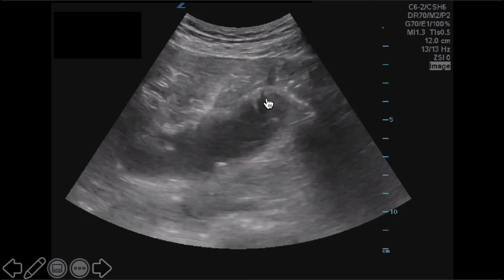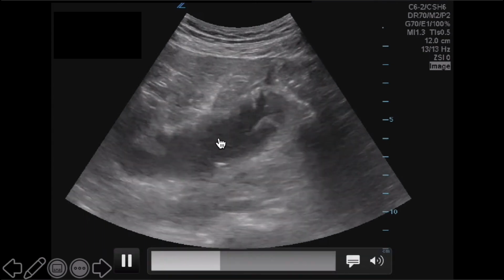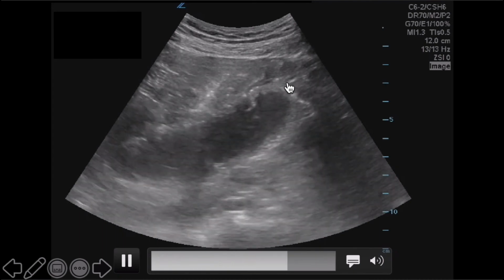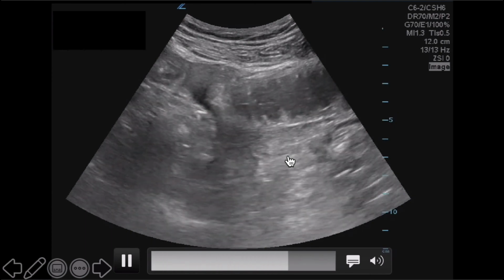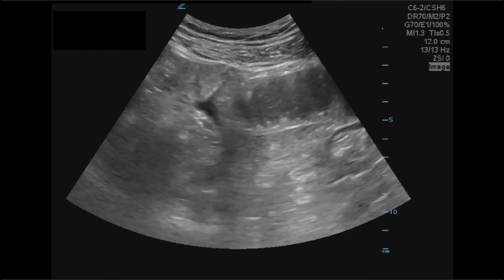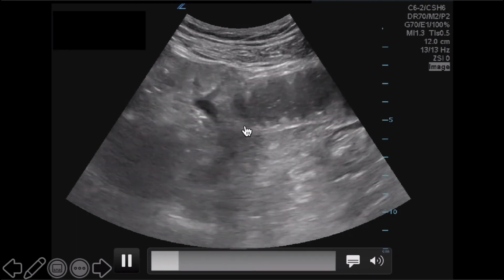Even without much ultrasound experience, most people could state they see a large fluid-filled tubular structure with movement of fluid contents within that structure. Another clip shows a more classic view of what can be seen with this specific pathology. What we are viewing is small bowel, and the finding we are witnessing is abnormal peristalsis, represented by the back and forth movement of bowel contents.